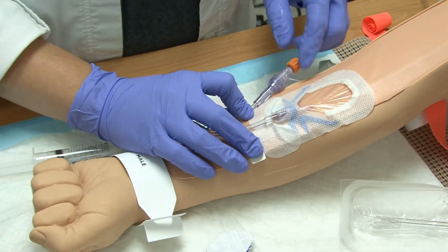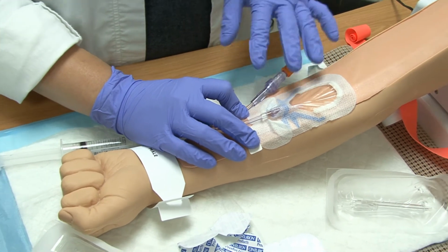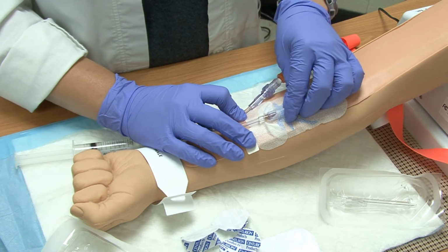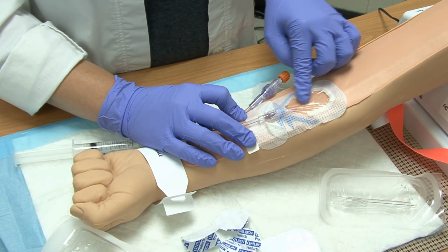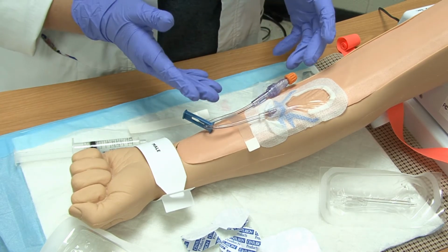Now, in some agencies, before you put on the actual securement device, they may have some type of skin protectant that you might put on underneath the skin. But always remember, until you get this covered, you do not want to be touching the site in here because you could contaminate the site and cause your patient infection.